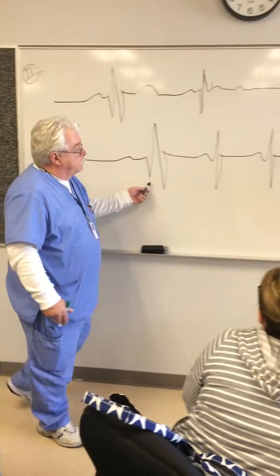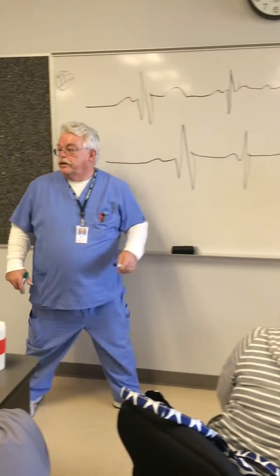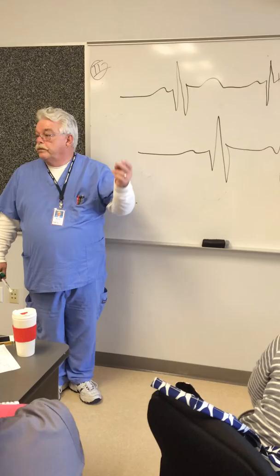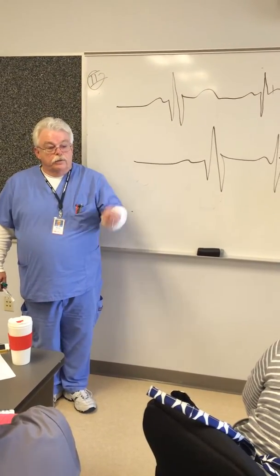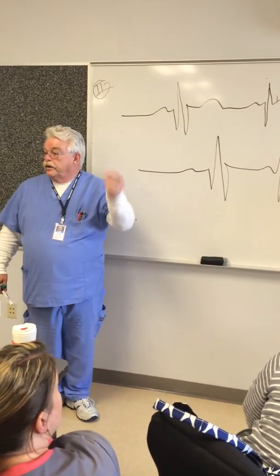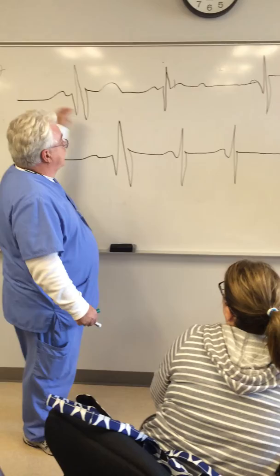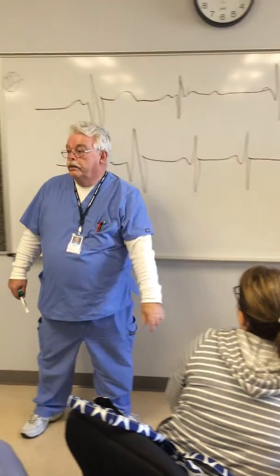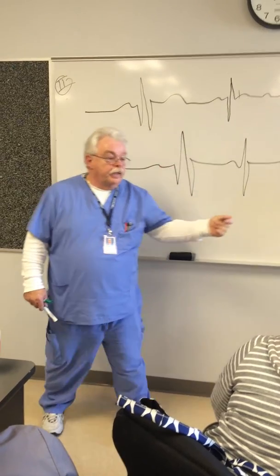This is fairly regular, boop, boop, boop. That's coming where you would expect to see it. If you're counting time, 1, 2, 3, 4's missing, you get 1 on the 1 again. 1, 2, 3, 4's missing, you get 1 on the 1 again. But this stays the same, right? This one, you get 1, 2, 3. You can start the whole thing over again, and it may be a different rate, right?